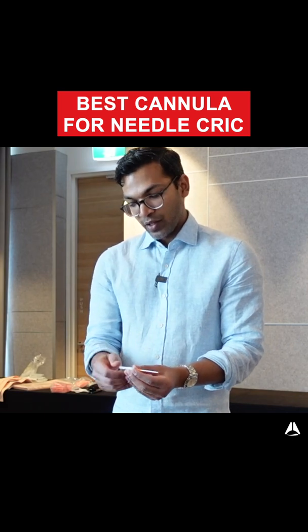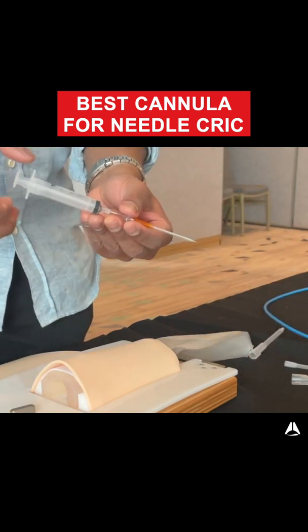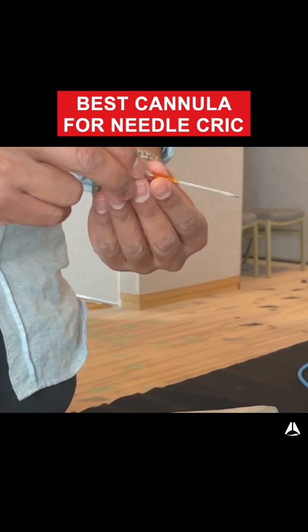The BD Insight cannula is really useful because first of all, you can take the back of the chamber off, and that's where you can attach a syringe and check for positive aspiration of air. Also, this cannula isn't a safety cannula, so you can reinsert the needle.